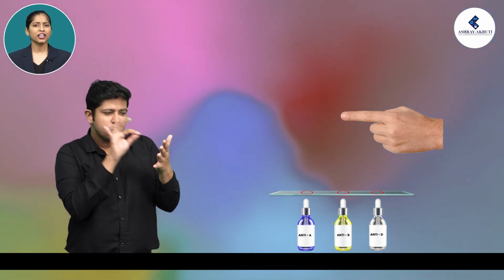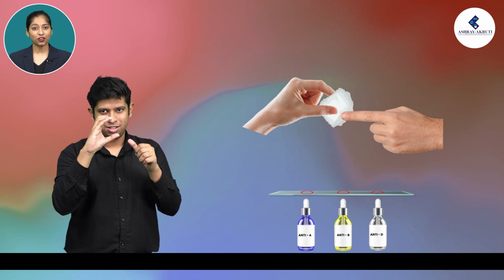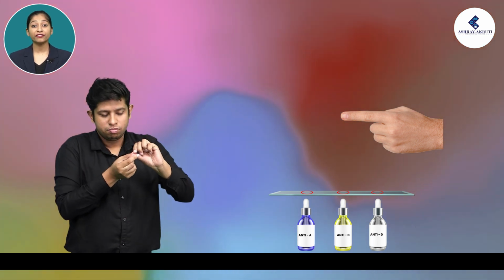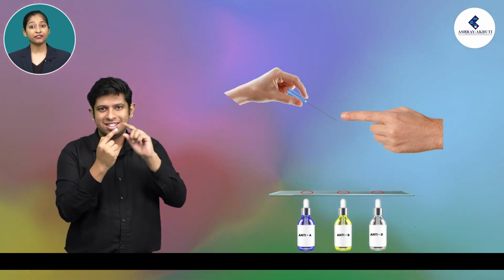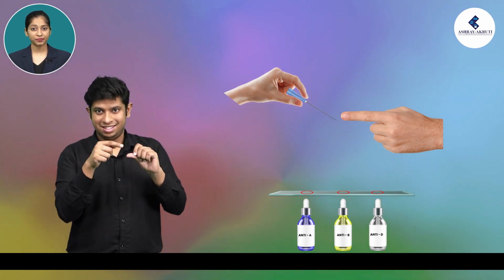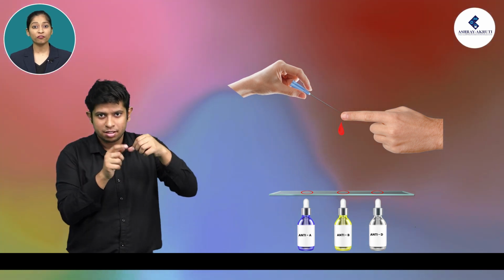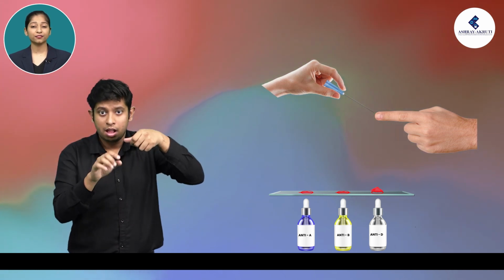Choose a finger, usually the left ring finger. Clean this fingertip with alcohol on a cotton ball and let it dry. Press on the bottom of the fingertip with the thumb of the same hand. Quickly prick the fingertip with the help of a needle. Note: the needle is sterile, so do not touch the fingertip with anything before using it. Quickly let 1 drop of blood get into each circle, but not touching the antisera.